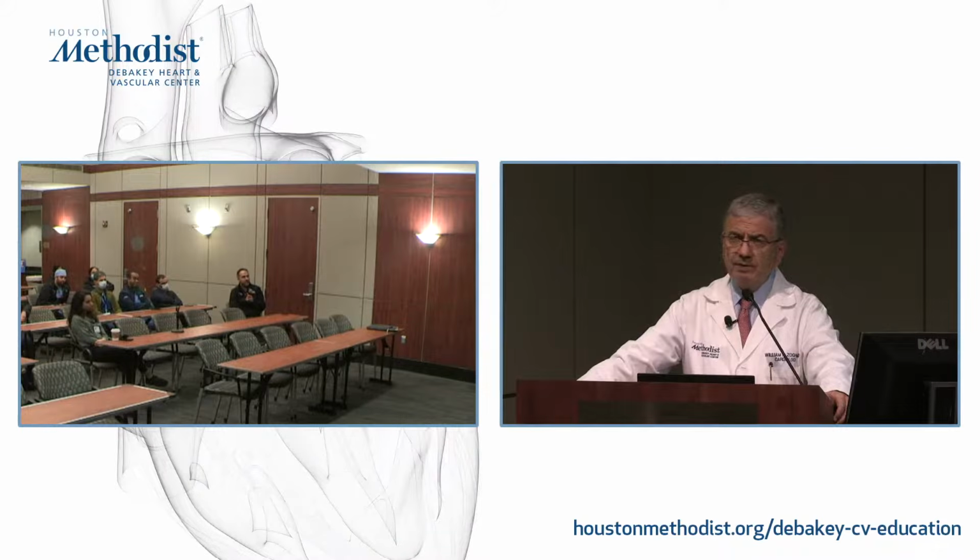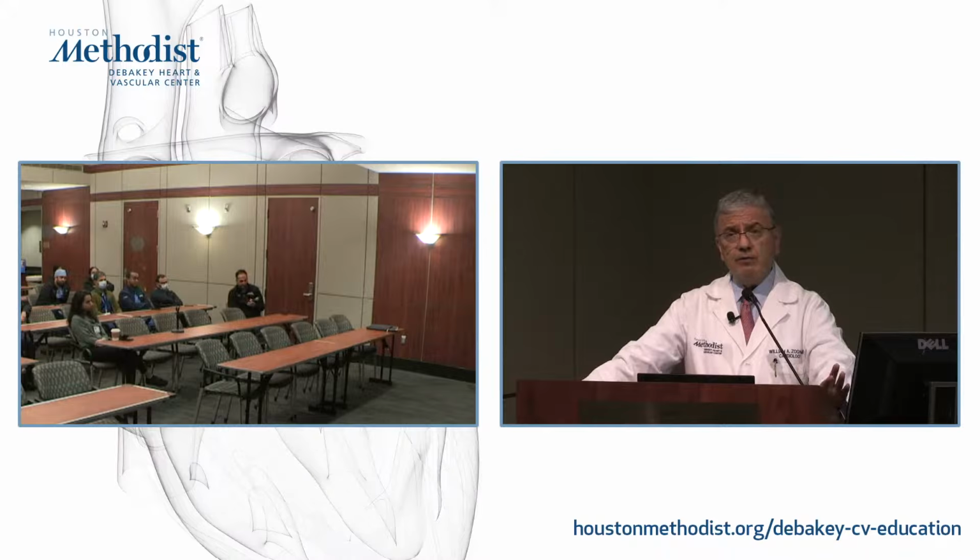Going back to Safi's question, I think it's critical when you use ventricular volumes to assess valvular heart disease. I'm not talking about volumes measurement and volume, because you have to go by the guidelines and the serial changes for that particular methodology.